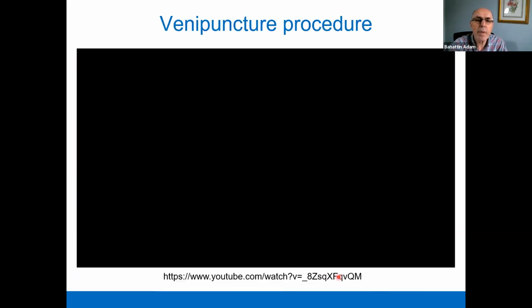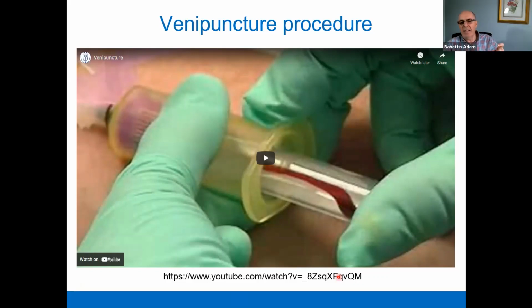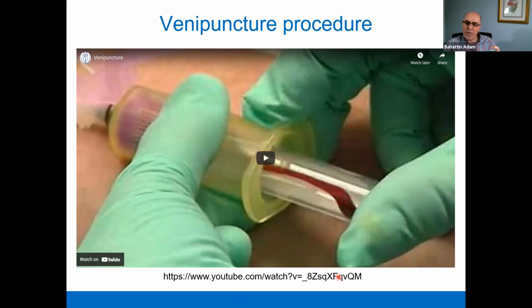Dr. Adam, what was the answer to the question about the coagulation of fresh blood being prevented through the use of an anticoagulant? The answer is plasma. If you use anticoagulants, the supernatant, the fluidic part of the test tube, is plasma.